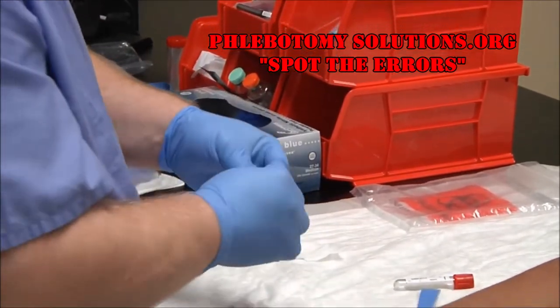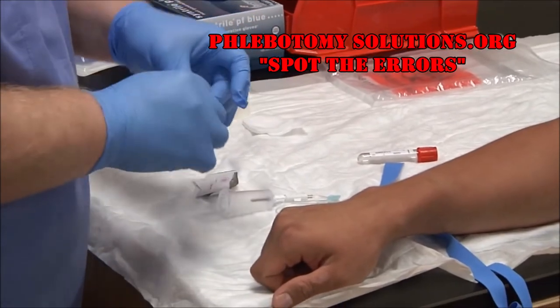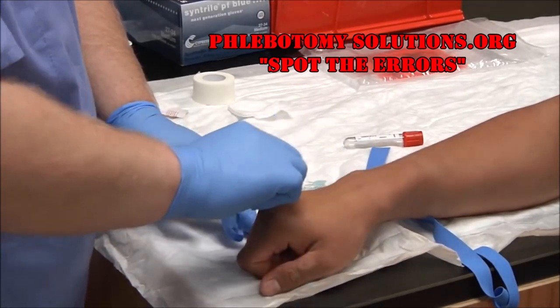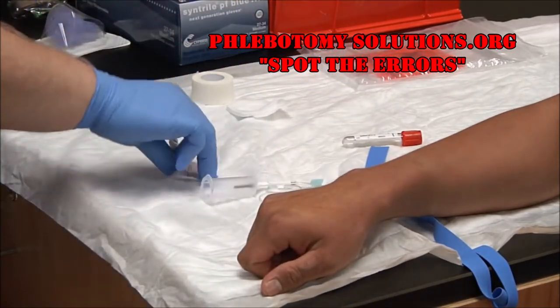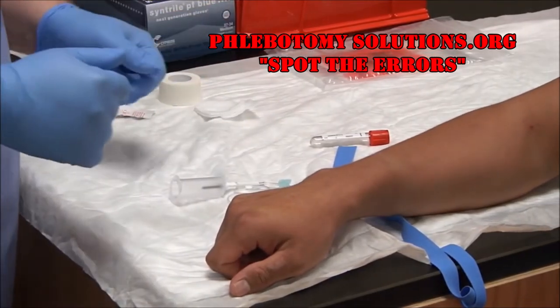With gloves on, go to the center point of where you plan to insert the needle. Starting a circle and moving inside out, pushing the dirt away. You want to do this in about a two-inch pattern. Used alcohol pads can go in the regular trash.